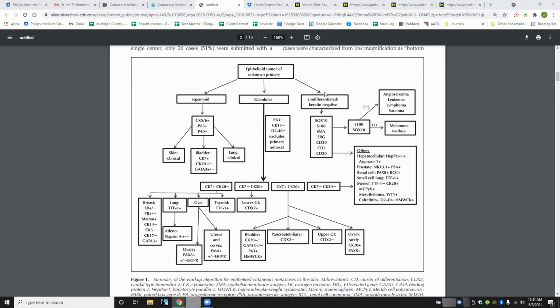You try to very carefully hunt through the tumor and see if you can find, maybe is there some hemorrhage? That would be a clue to maybe some vascular differentiation, or if you can find some ductal lumina, glandular differentiation, or if you can find something that looks a little sebaceous, then you would kind of go maybe down one of the arms of this pathway without having to order everything.